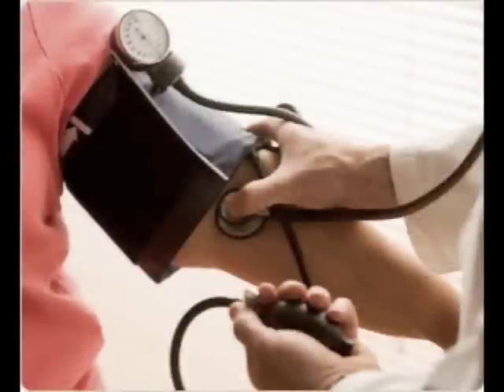The purpose of this presentation is to look in more detail at blood pressure and the device used most commonly in assessing blood pressure, the sphygmomanometer. Arterial blood pressure is considered one of the human body's vital signs in that major abnormalities indicate serious health concerns. Although low blood pressure or hypotension is a condition that can lead to major problems, healthcare professionals are more frequently on the lookout for high blood pressure in the general population.